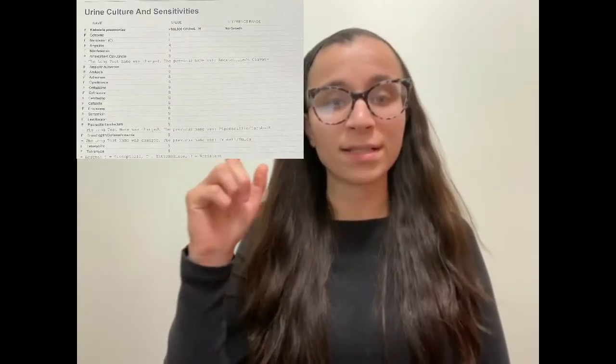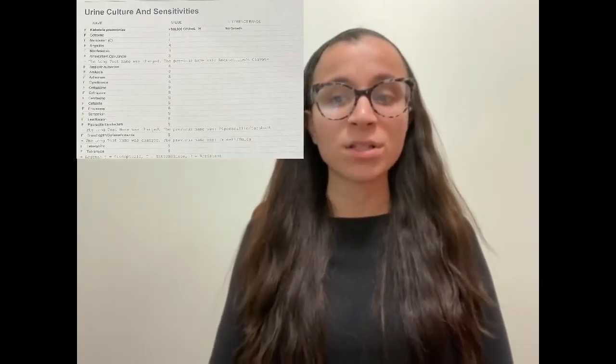Now, one more thing I want to point out. In terms of the microorganism, if you look over here, it says no growth and it says more than 100,000. Urine normally should be free of bacteria. It shouldn't have any bacteria. But sometimes it could get contaminated from even just inappropriate wiping before giving the sample. So if it's more than 100,000, then we say it's positive. If it's 10,000 to 100,000, then it's indeterminate. And if it's less than 10,000, then we say negative for UTI.